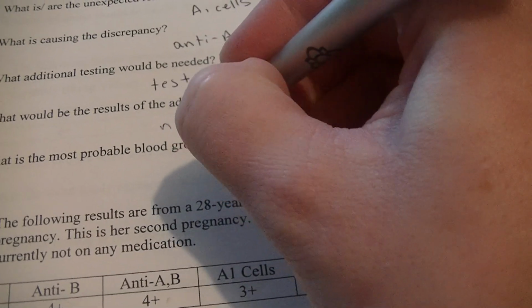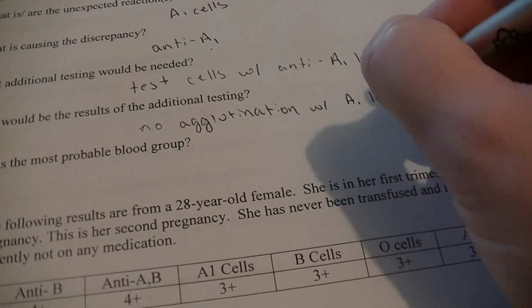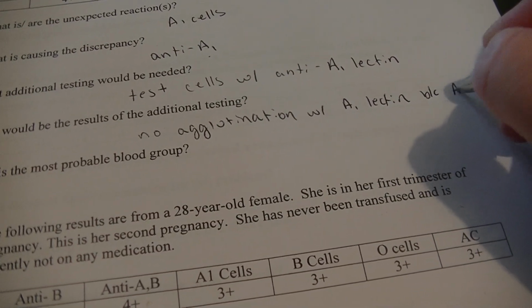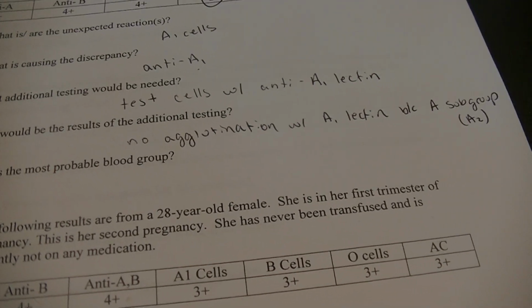No agglutination with A1 lectin because they are an A subgroup or subtype, probably A2 because it's the most common subtype.